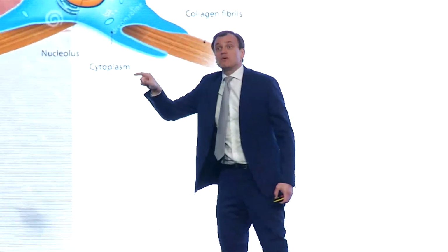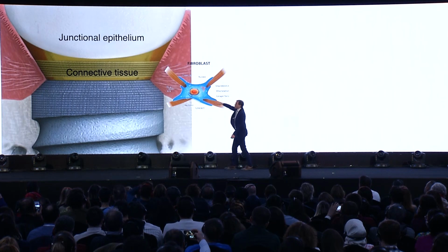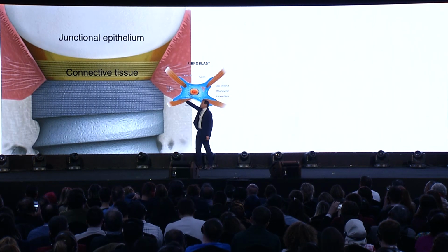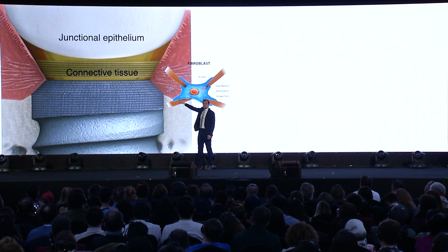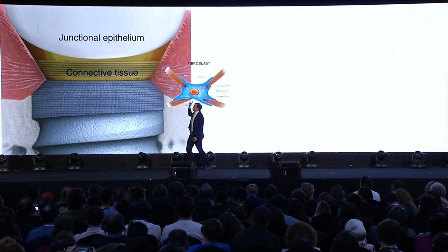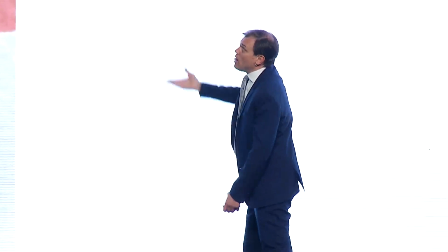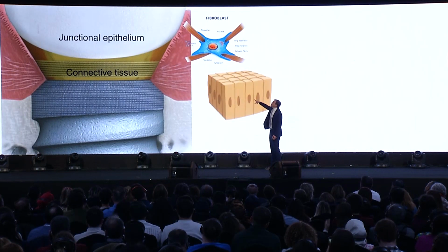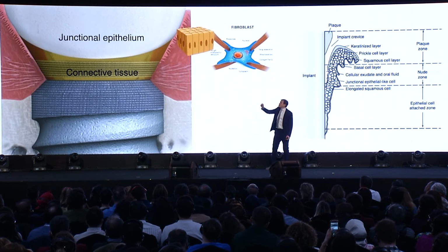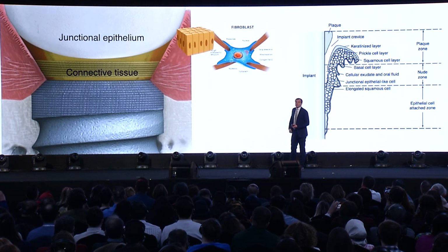Schematically, again, let's repeat it because it's so important. That's, again, how we connect everything together. We place the implant. 1 to 1.5 millimeter above the bone will be connective tissue, scar-like tissue without any vessels. They just go all around the tie base contact with the implant. If we go up, then you have junctional epithelium, which lines the surface of zirconia and no contact with the fibroblasts.